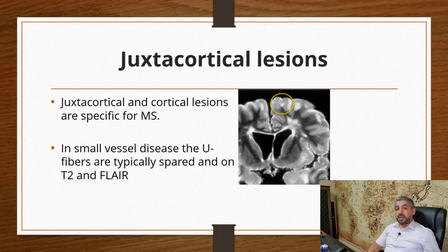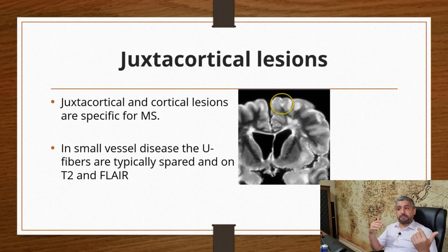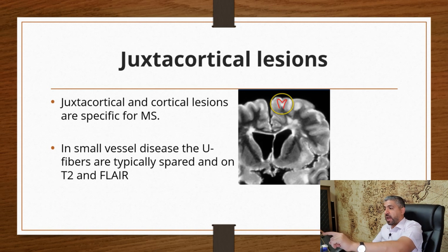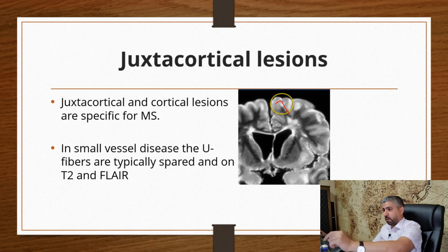Juxtacortical lesions are specific for MS. However, it can be difficult to distinguish them from small vessel disease changes, which is a normal aging process. To differentiate: when you see a hyperintense area, make sure it touches the gray matter — the cortex — with no black line between the lesion and the cortex on FLAIR images. If there is any black line of white matter separating the lesion from the cortex, it is probably not an MS plaque; it is likely small vessel disease or normal aging.